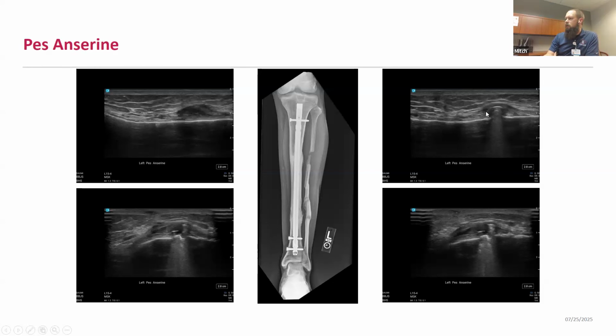And so that's another tool or feature that you can use diagnostic ultrasound for. We'll often use it in identifying hardware abnormalities causing persistent pain for patients. So routinely we'll see distal radius fractures with persistent tendon pain, or ankle fractures where you've got screws or other hardware causing mechanical irritation.